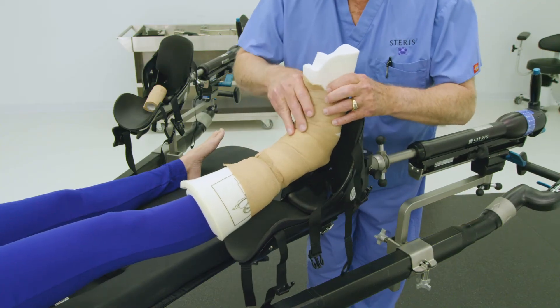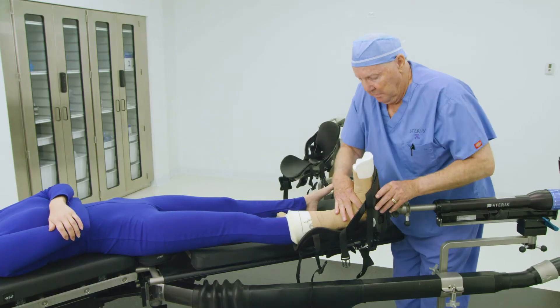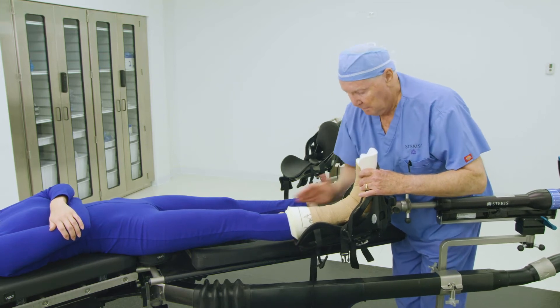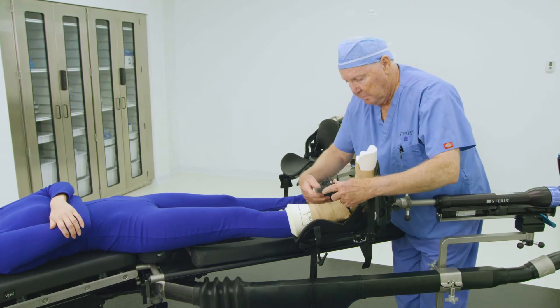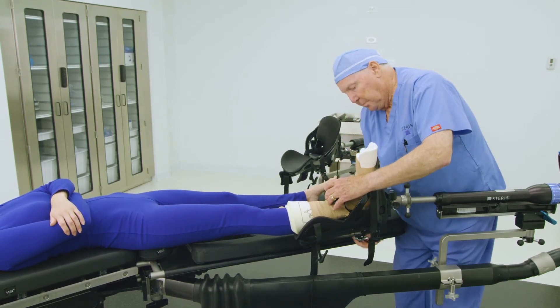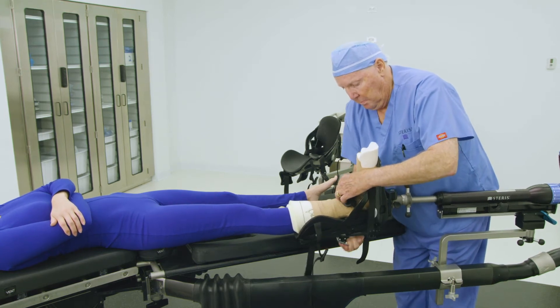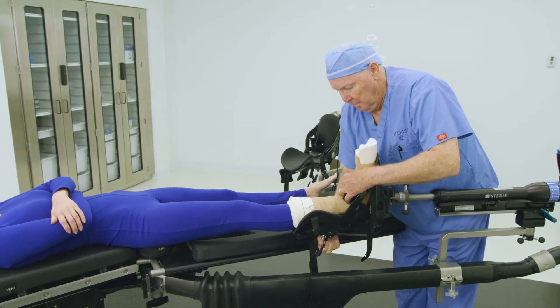Place the patient's foot into the boot so that the heel rests against the bottom footplate, and the foam padding is as close to the patient's calf as possible. Ensure the Achilles pad is positioned against the Achilles tendon. Next, buckle the middle strap and ensure the strap is directly over top of the ankle. On the underside of the boot, tighten the middle strap using the strap ratchet assembly until the ankle is secure.